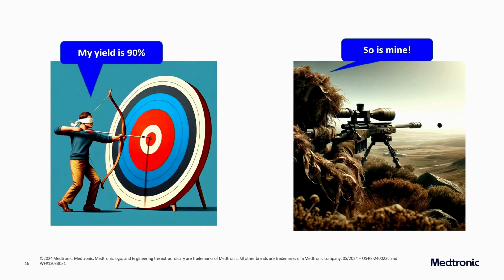Now, a couple of things about diagnostic yield. We defined diagnostic yield in a consensus statement paper that came out in the Blue Journal just a few months ago. I don't know if you saw it. If you haven't, you should look at it. We've decided to define diagnostic yield as we defined it in the study I just mentioned. And doing that, I think there's a misconception that now we are able to compare papers to papers, and this technology has 95% diagnostic yield, this one has 65%. You need to take a look at the whole thing. You need to contextualize what that diagnostic yield means.